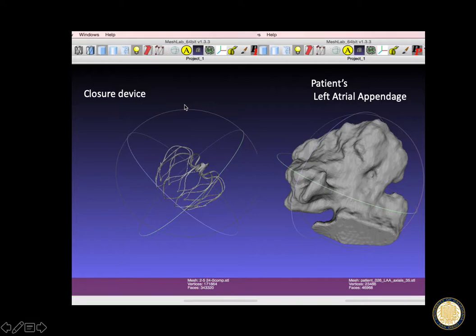The challenge there is that these chicken wings have a wide variety of shapes. And you're trying to put this singular device in, and the question is, does it fit? Will it actually close off that orifice? Am I going to realize that somehow I have to tilt it or angle it a certain way? Because you're doing this with catheters, you would like to do some planning ahead of time and maybe pick the right device off the shelf, or give a patient a probability that the device procedure will work. Maybe you give it a shot and you end up having to not deploy anything because it doesn't fit. But you can give that risk assessment further.